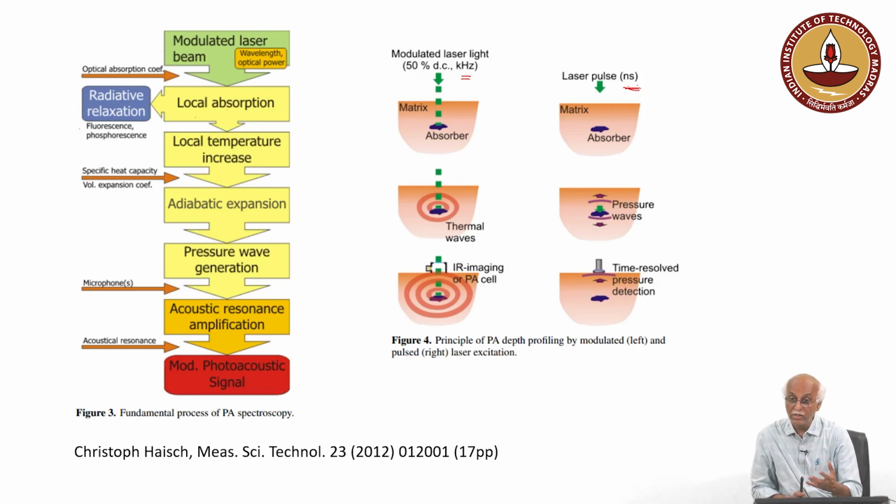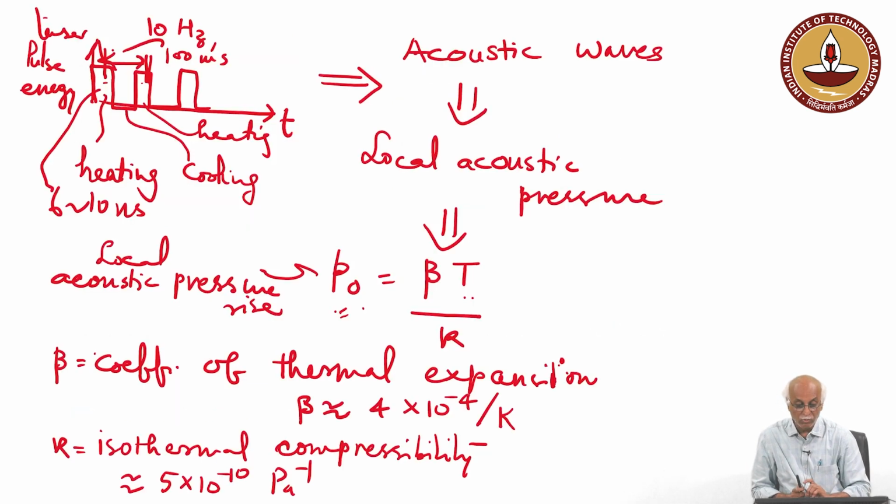Based on that also we may be able to characterize the tissue. If the tissue is hard or soft, depending upon that, the pressure change, the decrease in pressure change or the relaxation, the pressure plot characteristics with respect to time will be different. So, those aspects can also be captured.